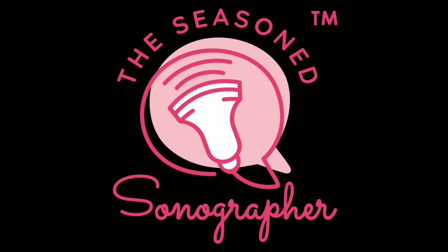When you're looking at the first trimester pregnancy, you're also evaluating for any abnormal findings, any pathology. An irregular shape of the gestational sac, or a thin gestational sac wall, may be suggestive of poor viability. No yolk sac or fetal pole when the mean sac diameter is greater than 25 millimeters is very concerning for pregnancy failure.